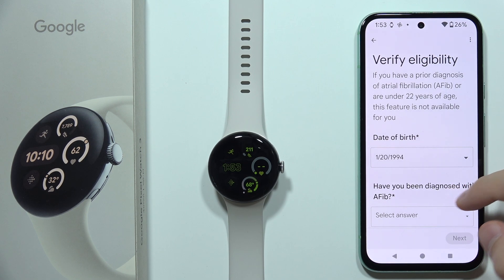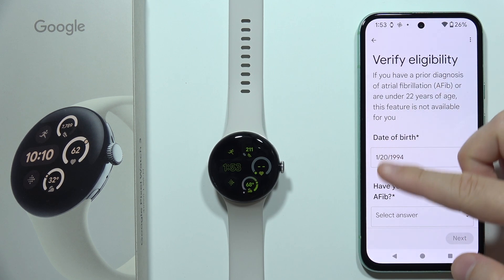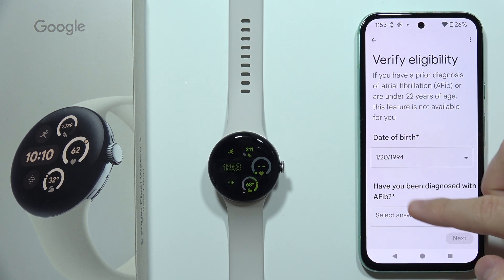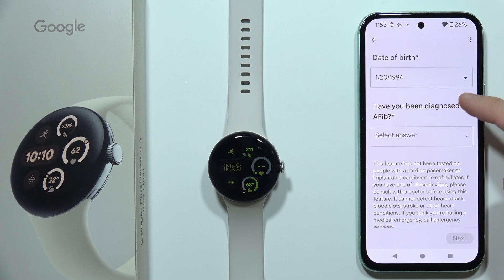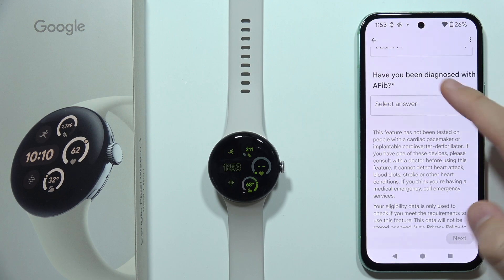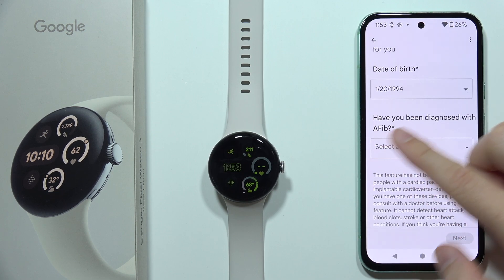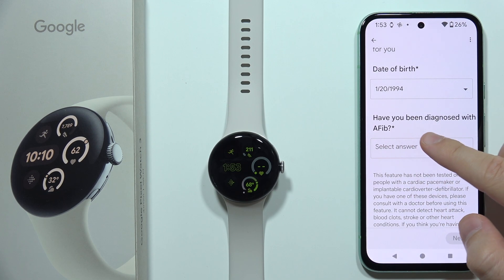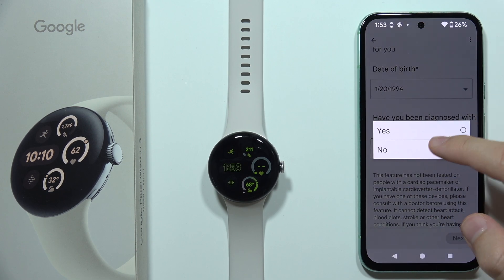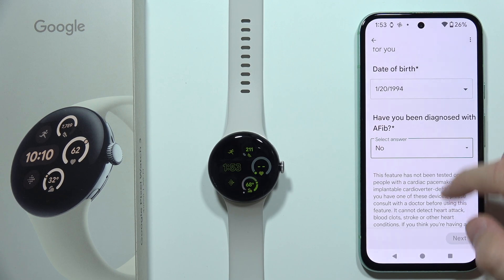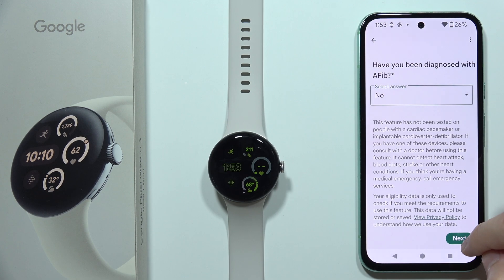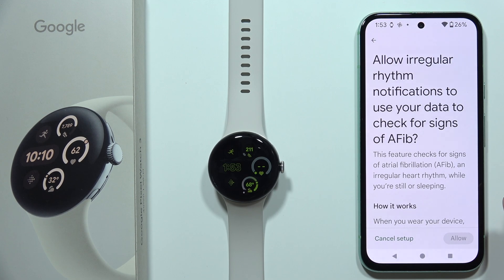Click 'Get Started' and here you will have to input your date of birth, then answer the question about whether you have been diagnosed with AFib, and click Next.